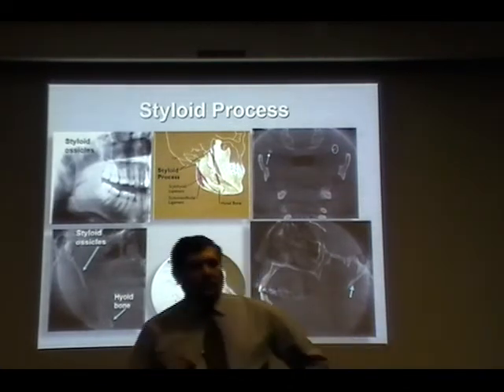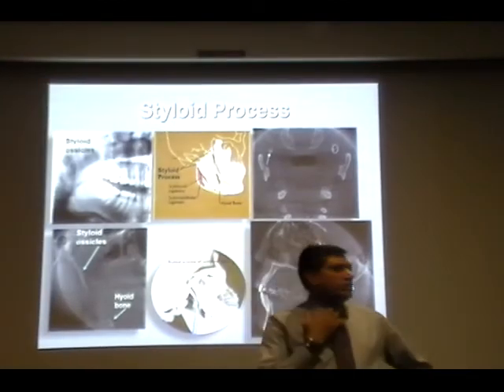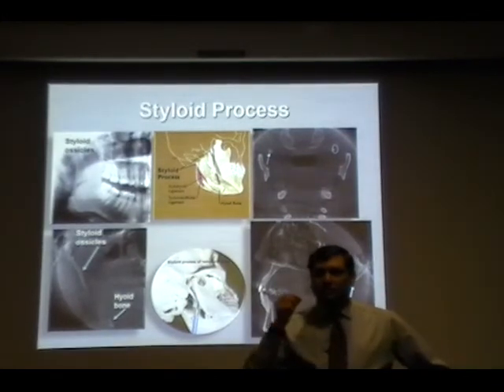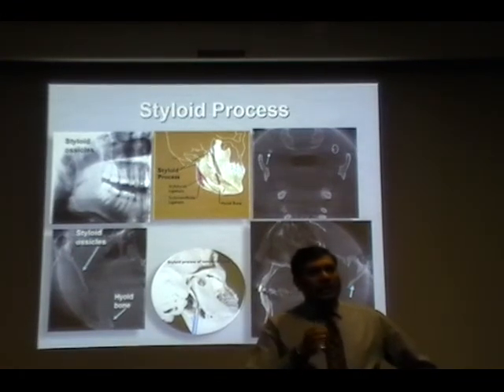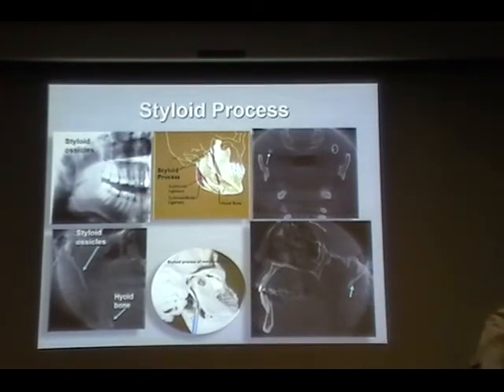You have to check this patient clinically, and when you ask the patient to turn the head like this, because of the sharp structures or ossification, patients will start complaining of pain. Only then would you refer to the patient as having Eagle syndrome, not as soon as you see the calcification.